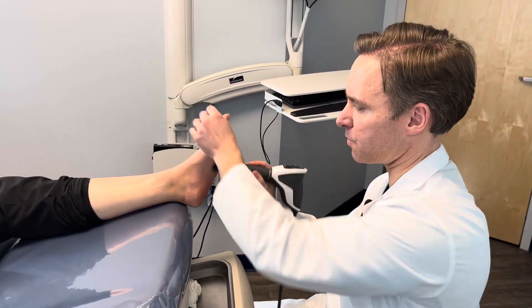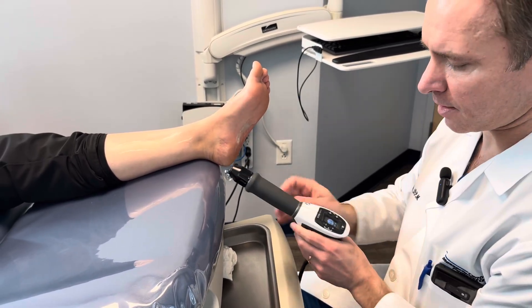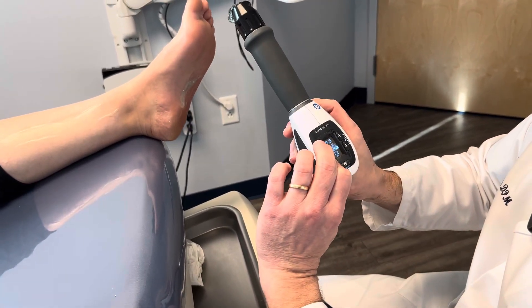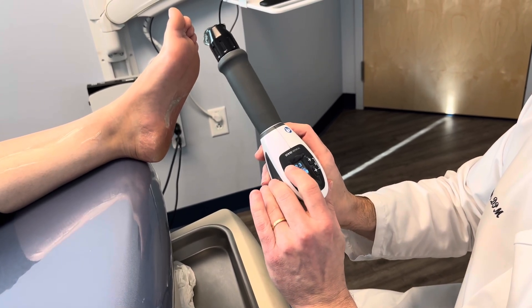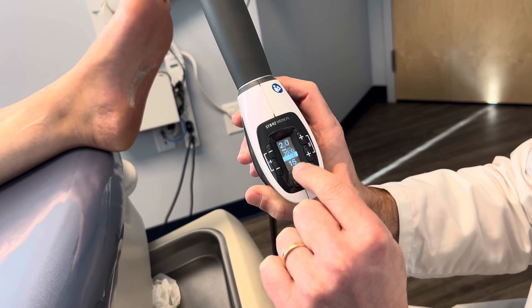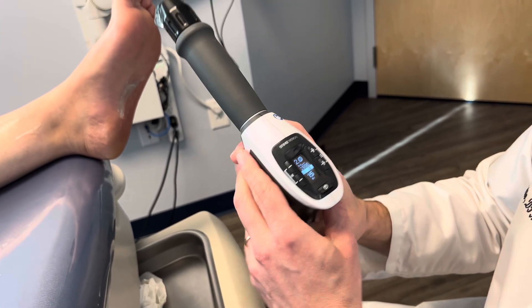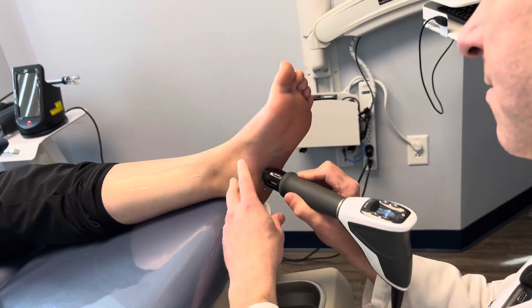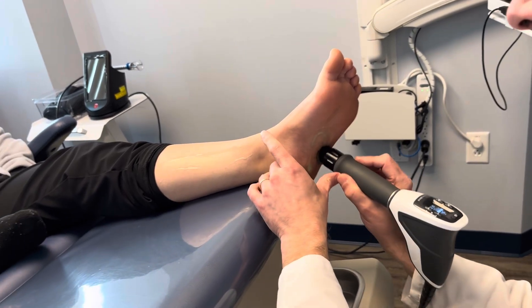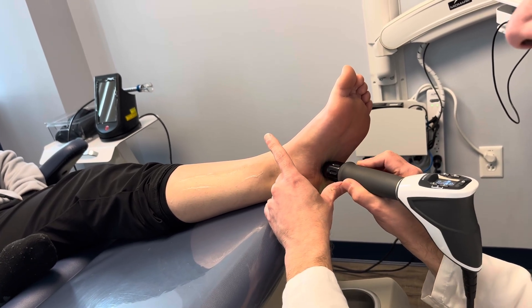For the plantar fascia, I do an area about the size of a dollar bill — that's the whole area. There are different settings. I usually reset it by hitting the two buttons on the side and start out at about two bars and 15 hertz. So 15 hertz is very fast, two bars is very low, and then I slowly increase it. I go back and forth the size of the dollar bill, putting a little pressure and reducing pressure in the arch.